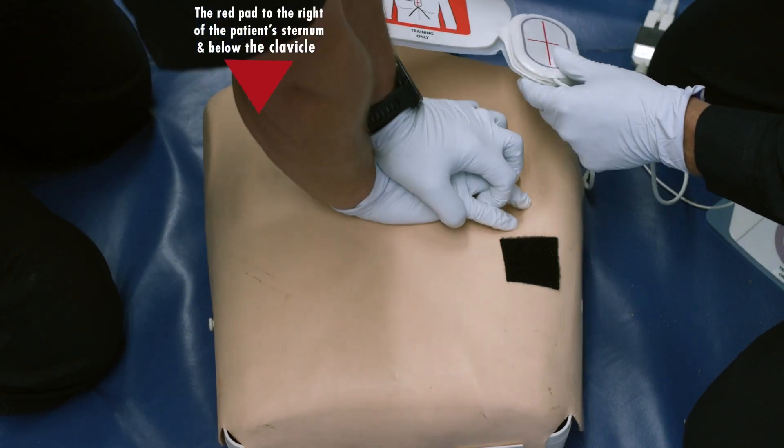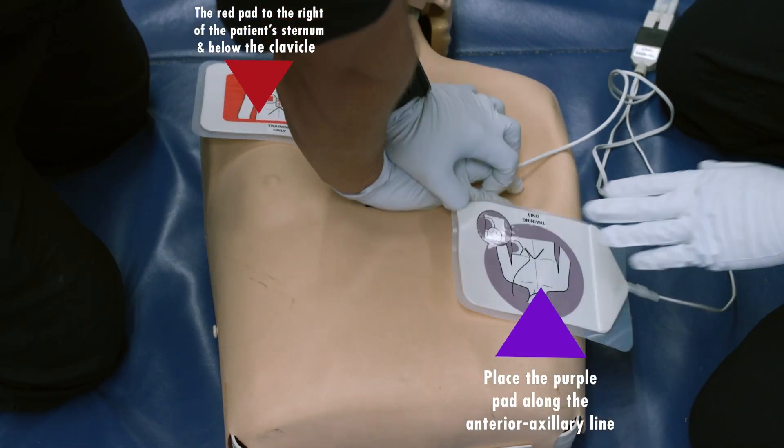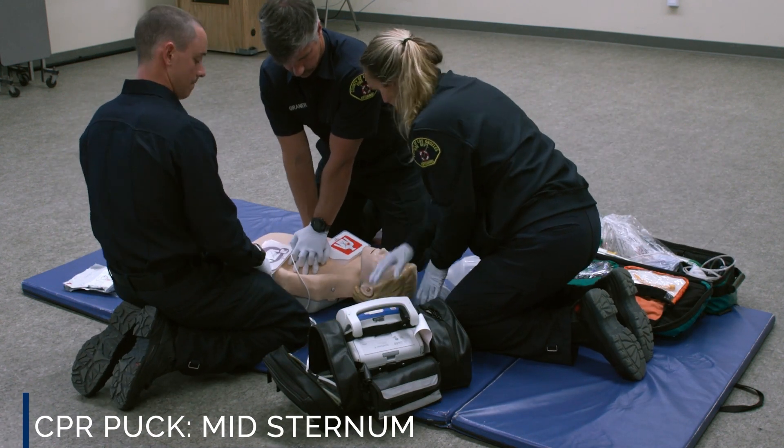Place the red AED pad to the right of the patient's sternum, just below the clavicle. Place the purple AED pad along the anterior axillary line. The CPR puck is to be placed mid-sternum as previously applied.